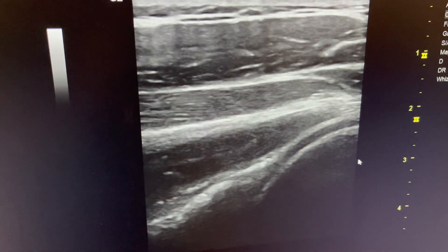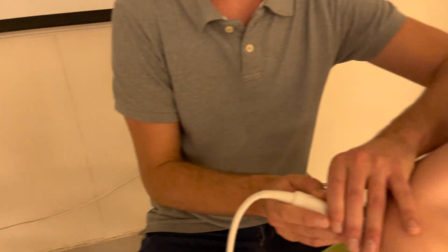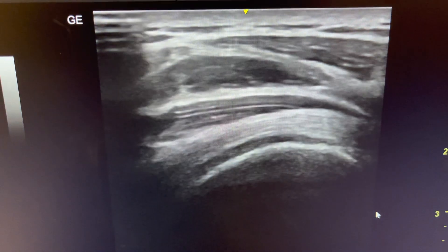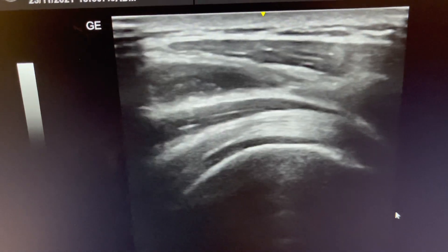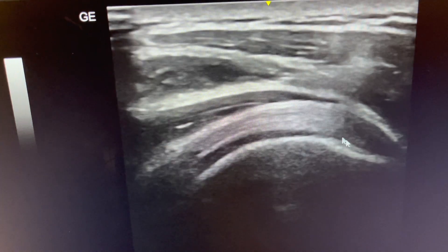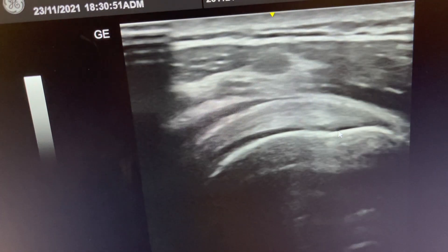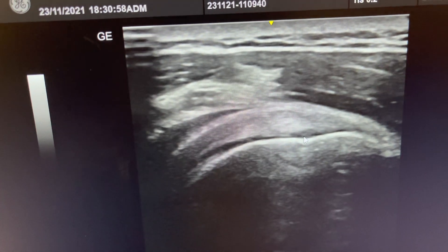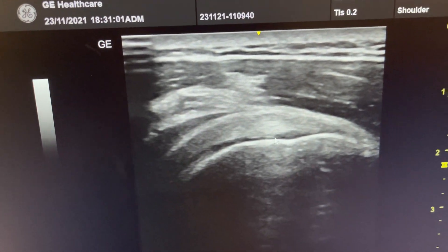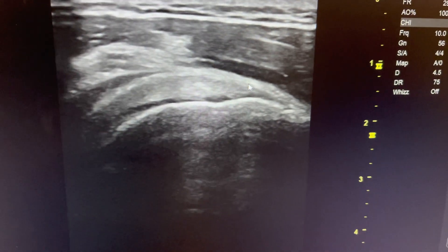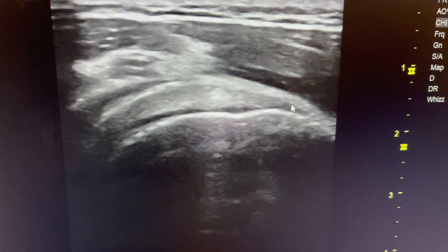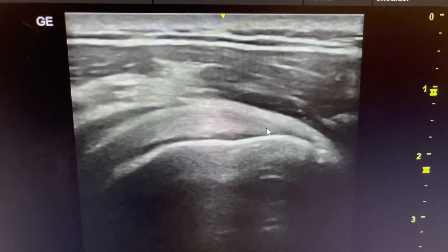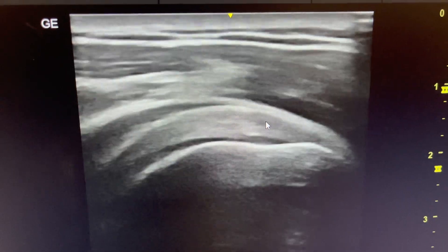So we're going to follow this hyperechoic line distally. Following it further, you have to go quite far — you see now the last bit of muscle above it is disappearing, and we should be left here with just tendon. We go further, and this is a really pretty image. We see the cartilage here, it stops here, and from here to there this is the footprint of the infraspinatus. It goes all the way till here, covers the whole facet of the infraspinatus, so the whole footprint is covered by tendon, and that means there is no tear — it's completely intact.